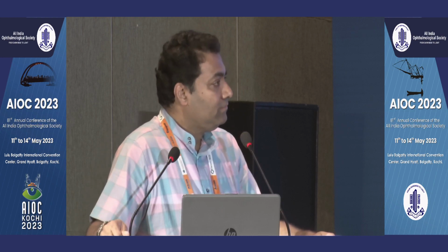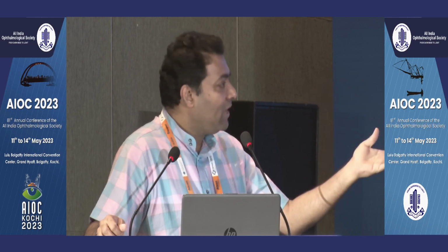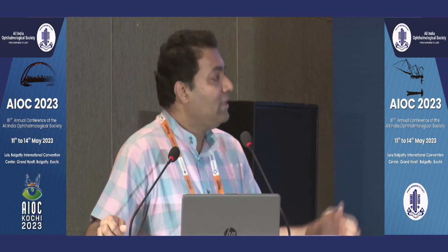So what do you think would be the cost? Because now we have so many devices for pre-op assessment, the pre-op assessment itself is becoming more expensive. It will be the cost of your OCT or topographer. It should not be more, because they just need to have different hardware. It's better for them because with the present hardware, they're not even reaching 5 microns resolution. This is going to 1. And if you add adaptive optics, it's becoming costly. But that's why Oculus is very keen, because all the companies which want to make the new OCTs are very keen on this. So I have no doubt that this should be the next generation of OCTs.